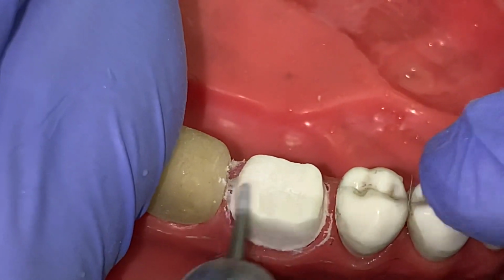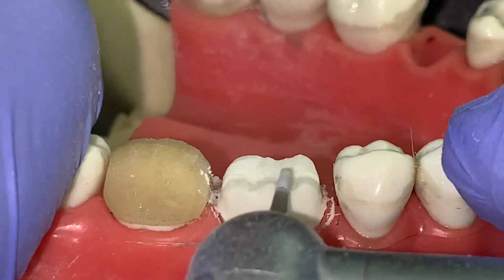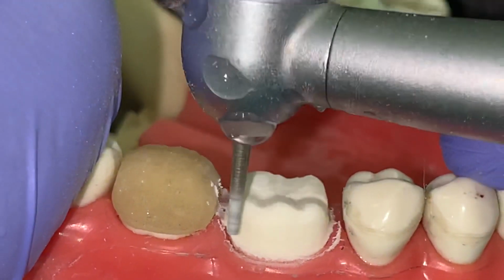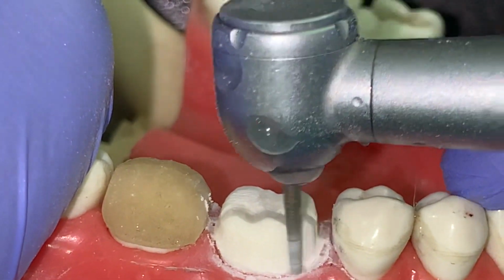Now these steps help your technician to make beautiful restorations. Otherwise, your technician will not be able to provide you some beautiful grooves in the center. It will be a flat kind of preparation or a flat kind of crown that you will be getting if you are not giving him the proper occlusal clearance.